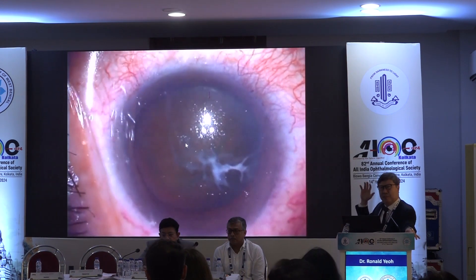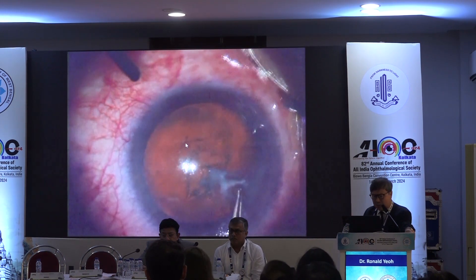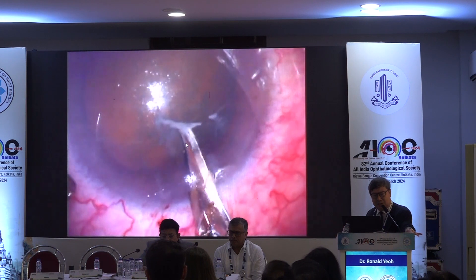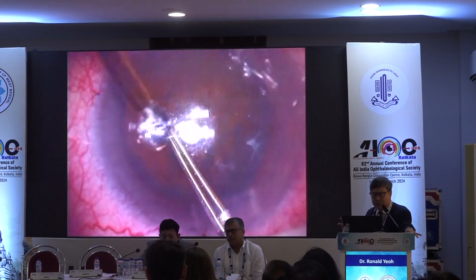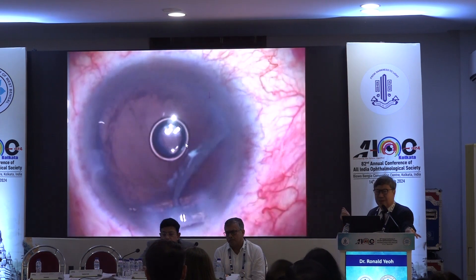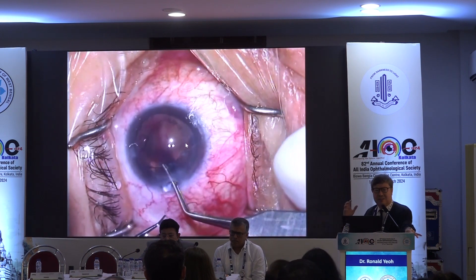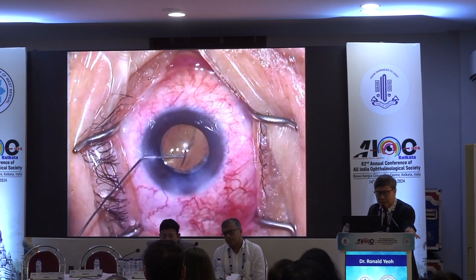What about this particular one? You can see this is a particularly nasty anterior fibrosis — it's not so organized as the last one. I'm tearing through here and I'm encountering resistance. You hold near the fibrous band and just test it. It was too resistant for my liking, so I take out the Vannas scissors, cut it, and complete the capsulorexis safely. When you've got a localized area of dense fibrosis like this, you've got to be careful. As I found out during the rest of the procedure, there was one quadrant of zonulysis. A CTR is put in just to stabilize it. When you see focal severe fibrosis like this, ask the patient whether they had a traumatic history, because forewarned is forearmed — and the patient had a good outcome.